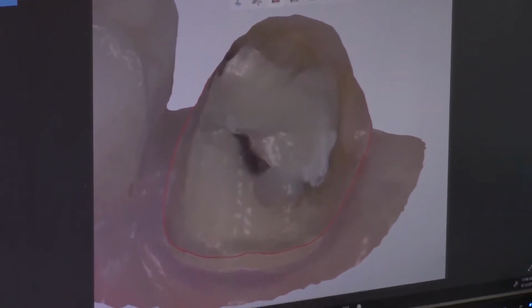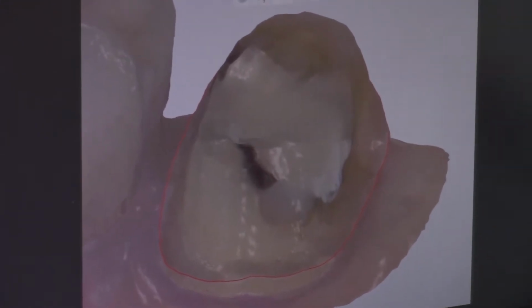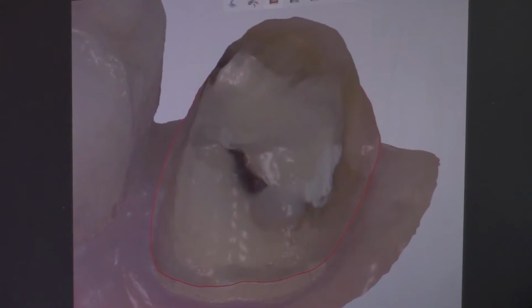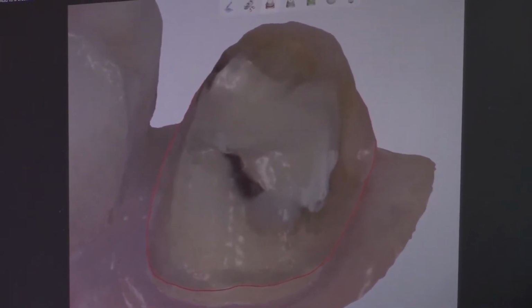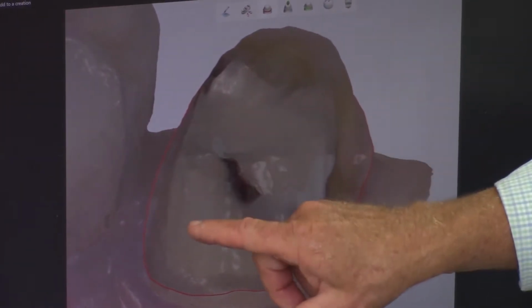Okay, and not all the systems are colored. We have the Sirona system, we have the Trios, which is actually our favorite as far as the images coming in. And then we have, you said Carestream is coming out with their color version. Yes. And I think PlanScan is as well with their Emerald camera. It is nice that we can see tooth colored and pink.